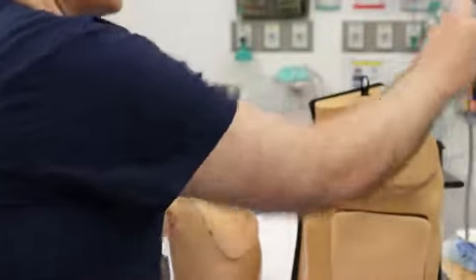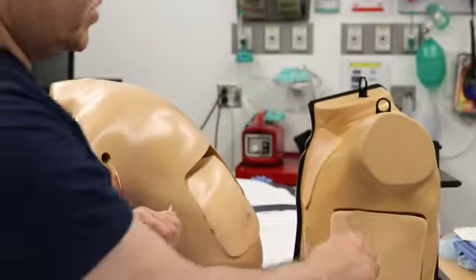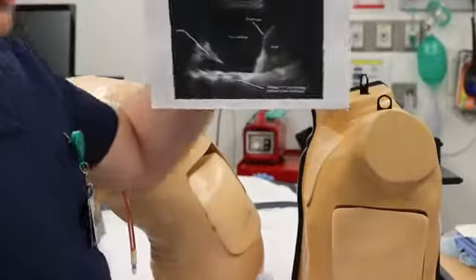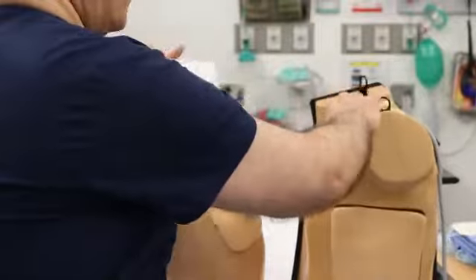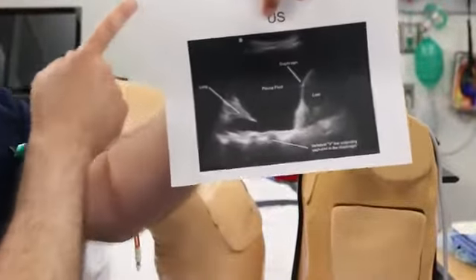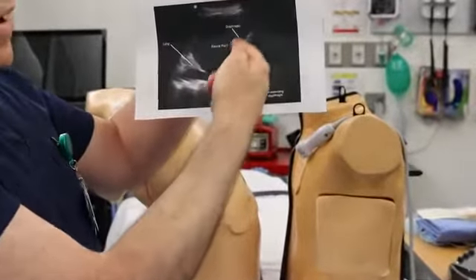So when I put my probe, this is my knob where the green dot is. So this knob should be towards the head of the patient. Then I will see this view. I'll show you on this paper, then I will show it to you on the mannequin. So what I will see, patient head will be here, and patient legs will be here, and this is your diaphragm.